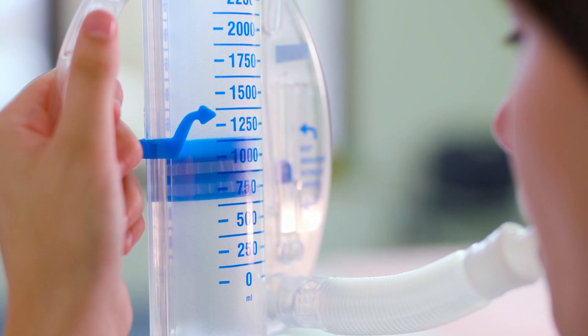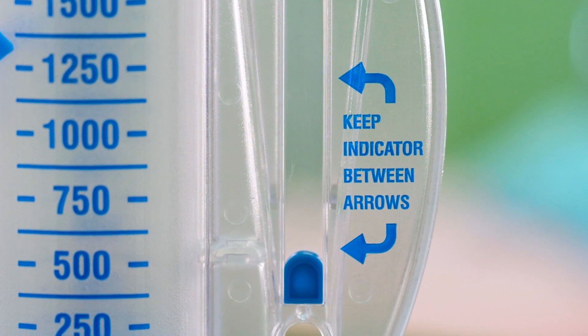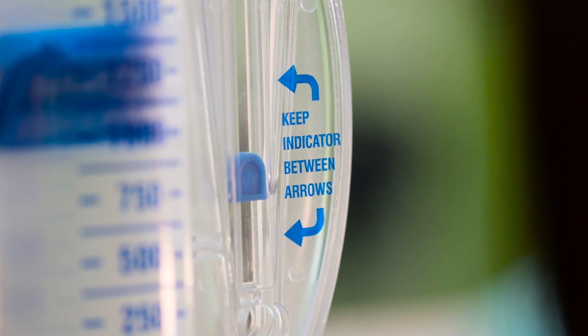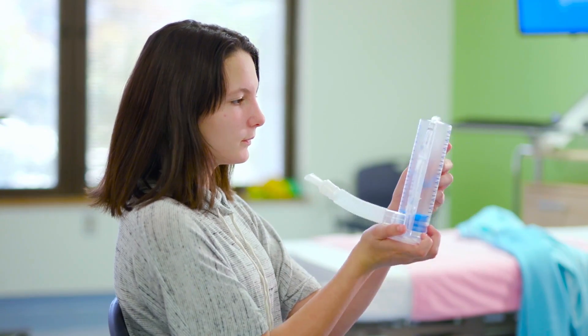A little disc called a piston moves up and down. The area with arrows or lines on it shows a range. A ball goes up and down in this range to show how slowly you breathe in.